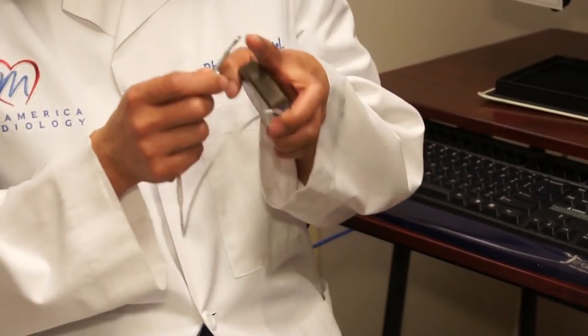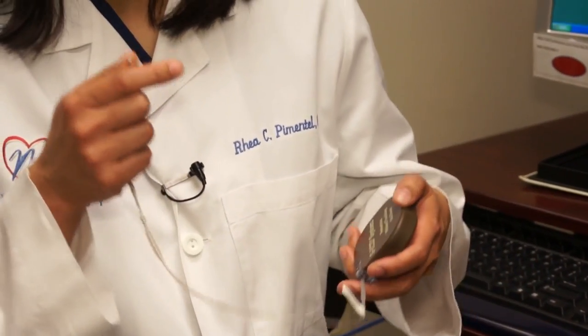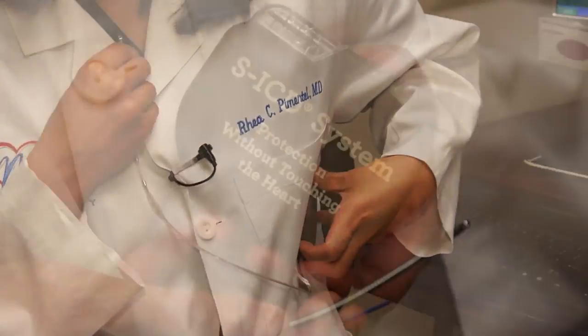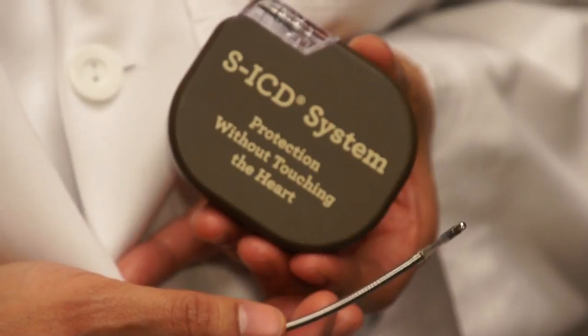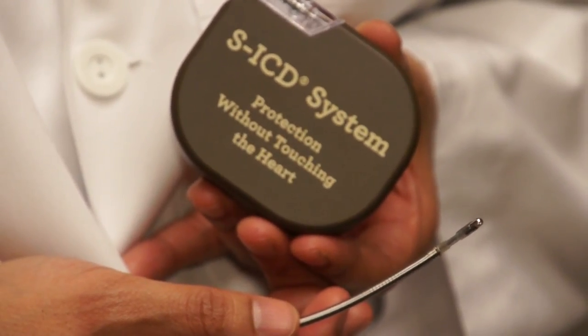What happens is that the very tip of this lead sits up here, and when you shock a patient, you shock from the tip of the lead to the battery itself. The biggest difference between this and the transvenous devices that we typically put in is we don't need to have access to the veins.